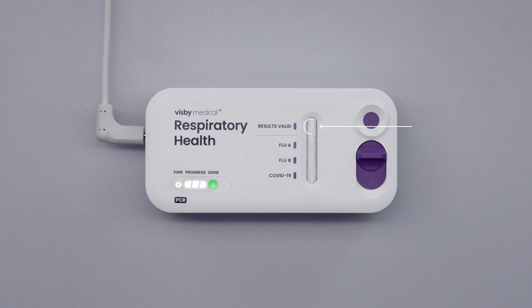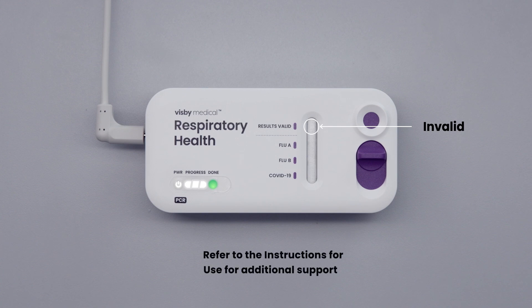If the results valid spot is missing, the test is invalid. If the test is invalid, follow the procedure in the instructions for use to retest or contact customer support.